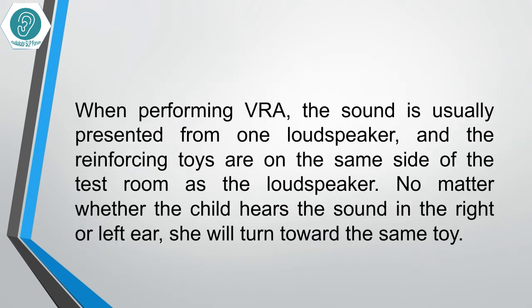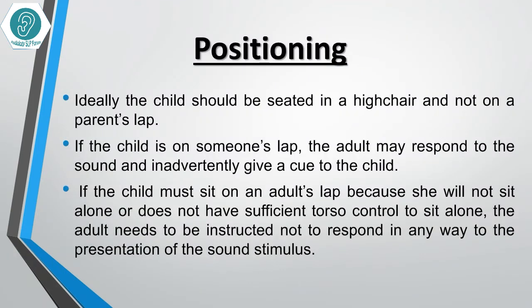When performing VRA, the sound is usually presented from one loudspeaker, and the reinforcing toys are on the same side of the test room as the loudspeaker. No matter whether the child hears the sound in the right or left ear, she will turn towards the same toy. Ideally, the child should be seated in a high chair.